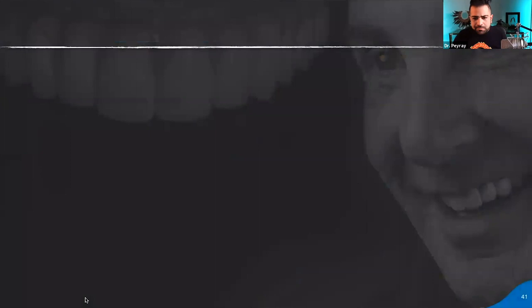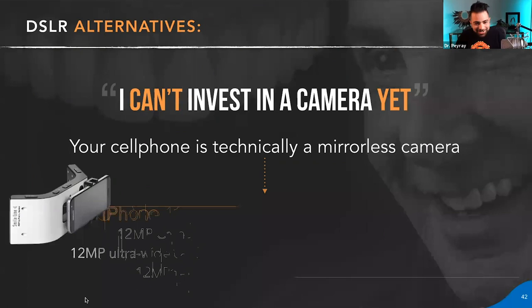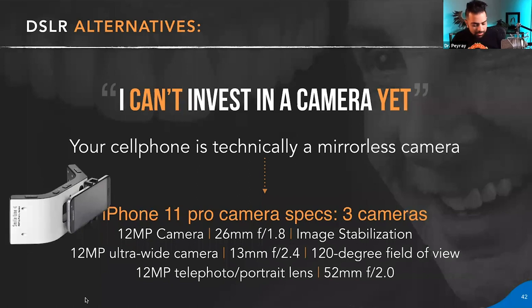Now, this is for folks that don't want to invest in a camera. I wanted to mention there's still hope for you because there are iPhones now that have multiple cameras. There's so many things you could use. And I showed you back in 2014, I was doing iPhone and it was working fine. So don't think that you need to invest in a DSLR. I do think that if you really want to be a good dentist, you have a great opportunity to not just be good, but also look at your work, because part of what we say, and I didn't really discuss, is that the pictures tell stories.